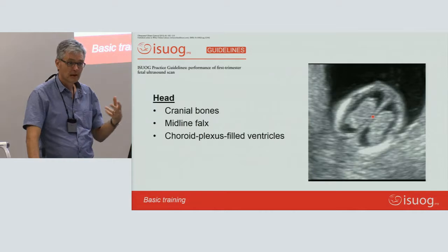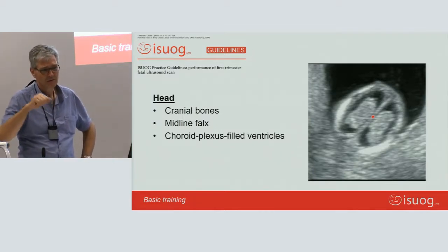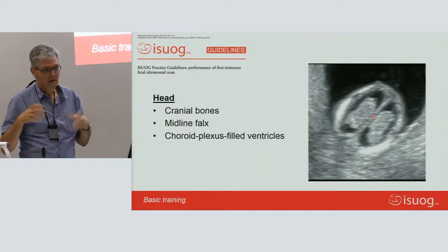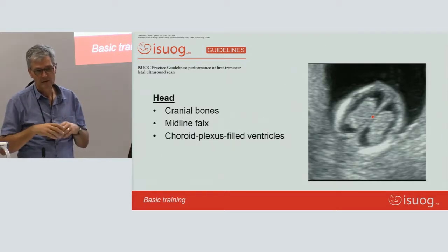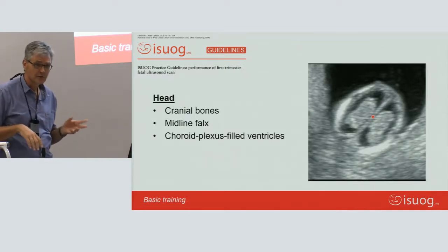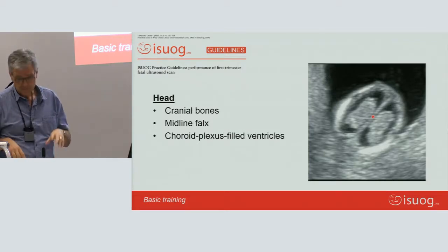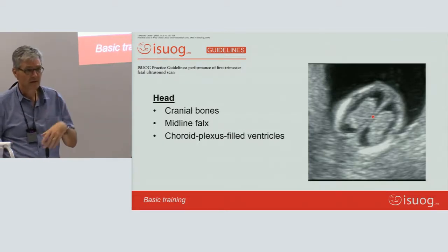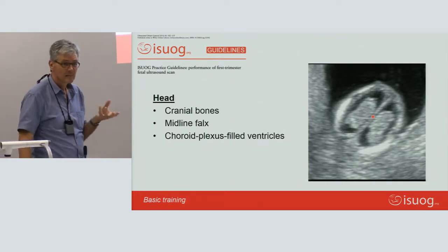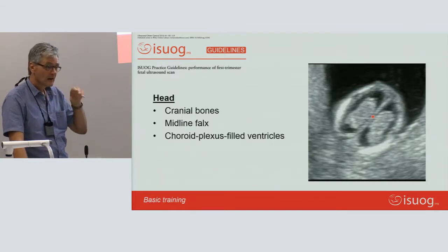And what probably happens is that you don't get the picture you want to see, you struggle finding it, and then in the end you decide, I just don't see it well for whatever reason. The woman has an unfortunate fetal maternal ratio, or she used Vaseline and that interferes with my ultrasound gel, whatever. And then you decide it's okay. And that's basically important as you go out and you start practicing this.